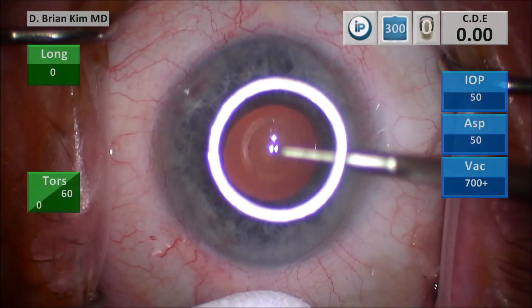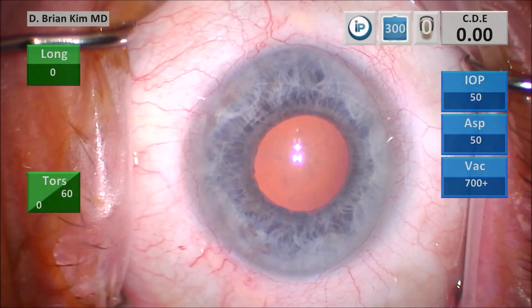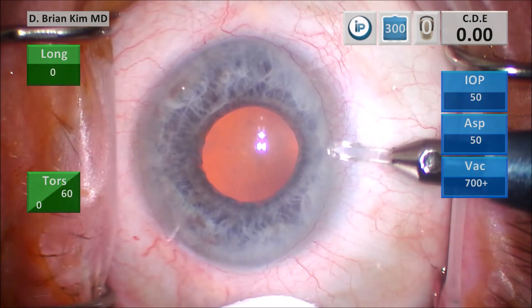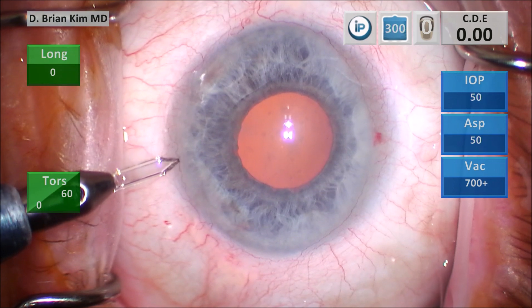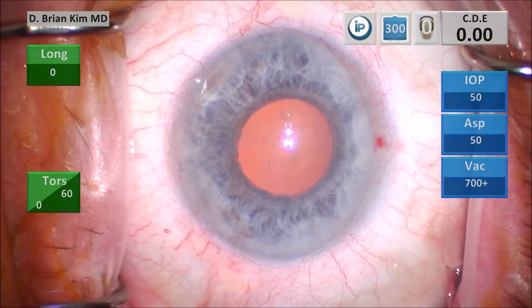I'm using a corneal marker to help me center and size my rhexis. You can see there's haze on the cornea on the central and right side of the screen. I'm going to make my paracentesis incisions first on the right side, which is superiorly, and then on the left side, which is inferiorly, making sure I have a nice corneal shelf, which will allow me to make a self-sealing corneal incision.